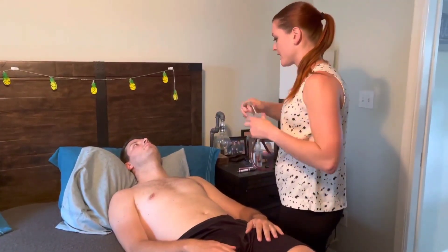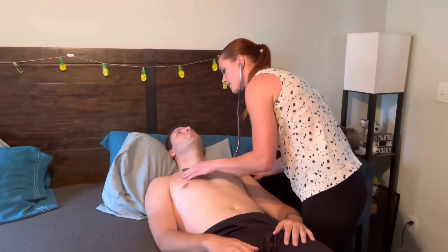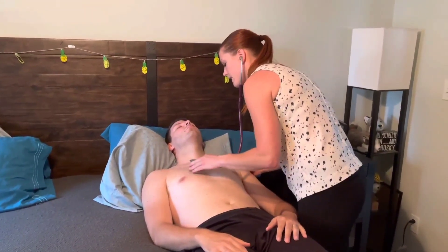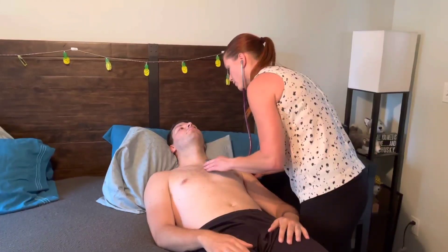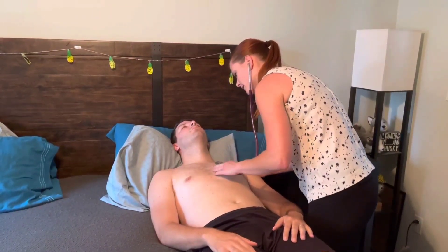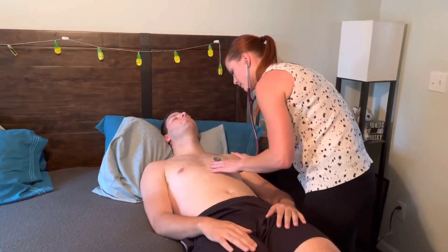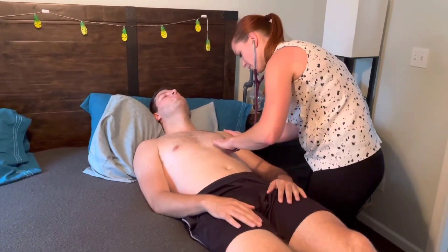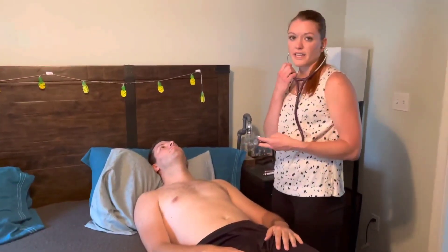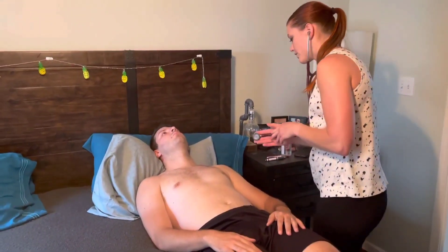Moving on to auscultation again, using the diaphragm first, listening to all areas of the heart for rate and rhythm. Aorta at the right second intercostal space, right sternal border. Pulmonic on the left side, second intercostal space, left sternal border. Down to the third intercostal space for Erb's point. Between the fourth and fifth for the tricuspid, and down to the fifth intercostal space, mid-clavicular line on the left for the mitral area. Then I'd go back through using the bell to check for extra heart sounds or murmurs, and listen at the apex in the left lateral position for signs of mitral stenosis.